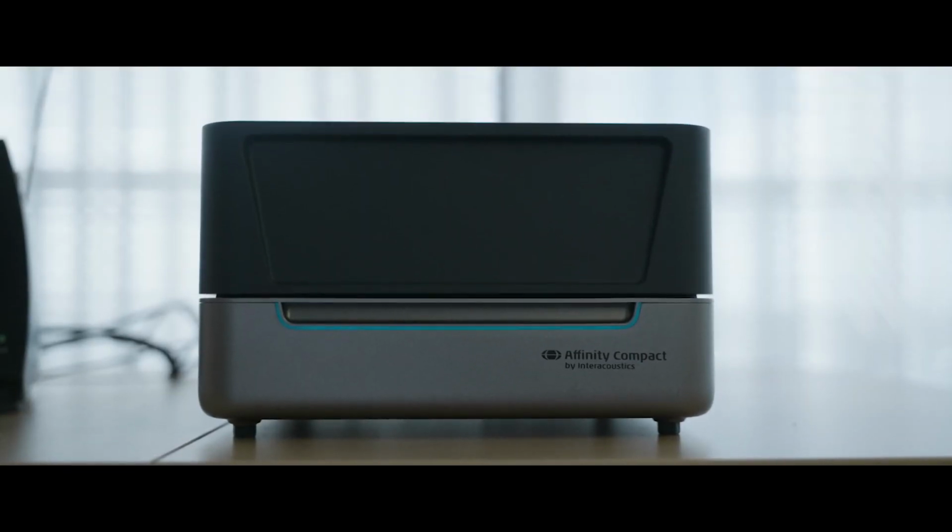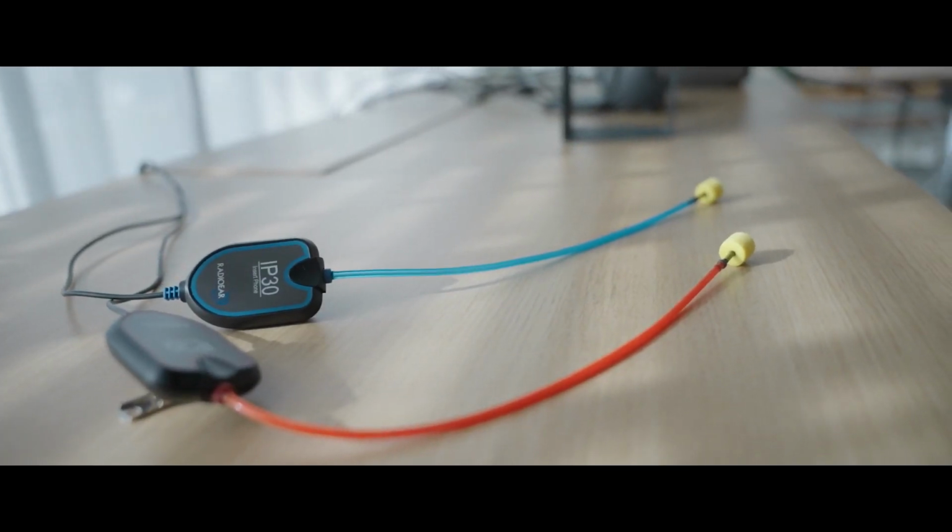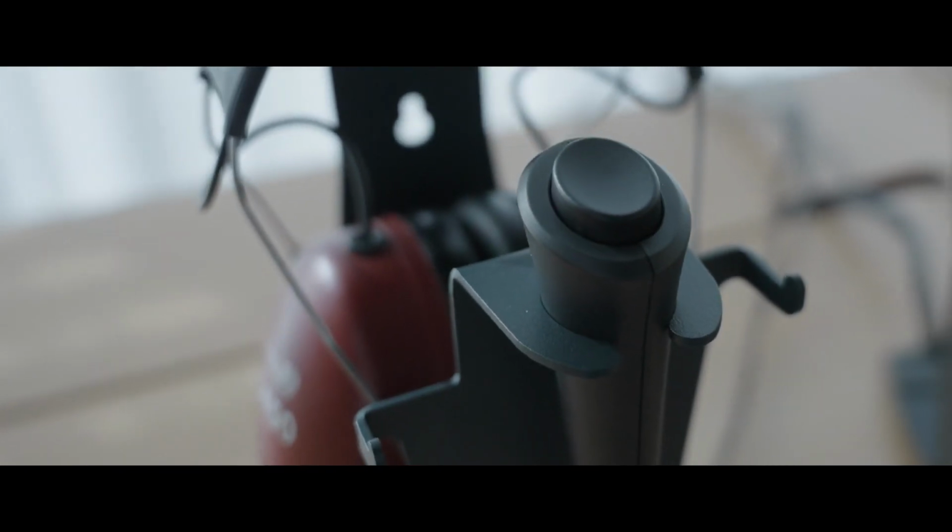So what do I need to get started? Very simple, really. You need an audiometer with an ACT license. You need headphones or insert earphones, both will work. Makes sense. And you need a client response button. As long as the client can perform audiometry, they can perform ACT.